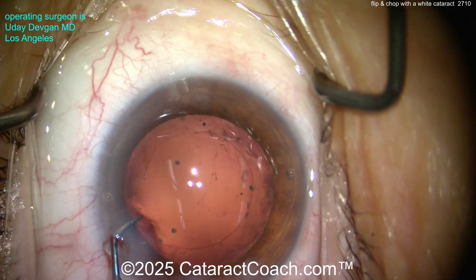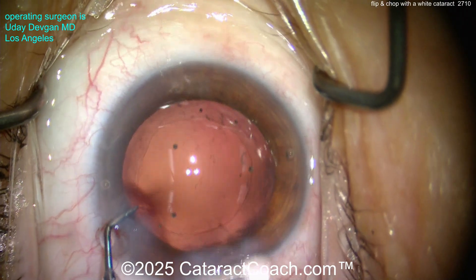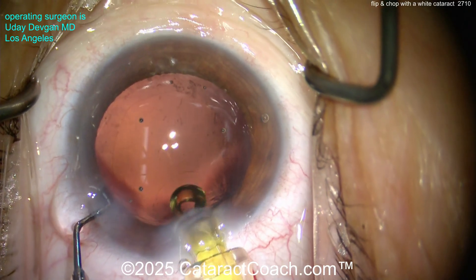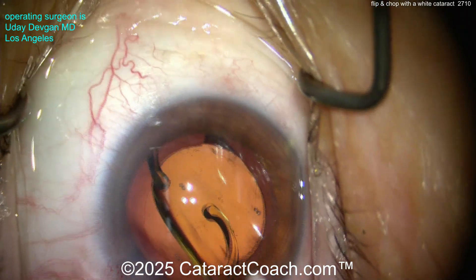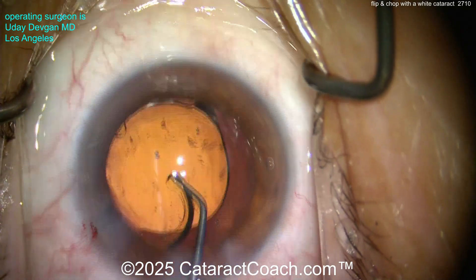I personally attest that flip and chop is very good for all kinds of cataracts. I get emails from people saying, 'I like flip and chop but it was for a soft nucleus — it's not good for a dense cataract.' Let me show you a dense cataract. Or, 'it's not good for a white cataract' — here's a white cataract, and I promise you it's good. The hands are more important. With fantastic hands you can use any technique, including flip and chop.